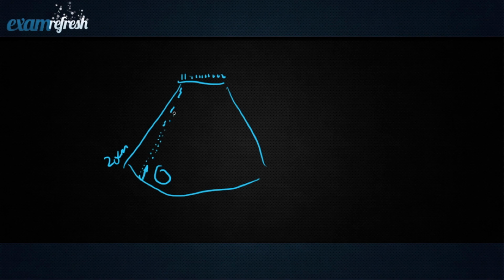So you have to wait that whole time. The machine will pulse every single crystal, wait for it to return, and then it will create one frame. So if you wait all that time to create one frame, this is why depth is such a big issue.